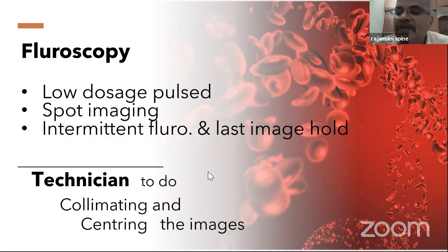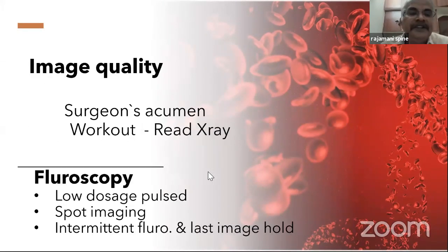But one major disadvantage of all these things is the poor quality of the images which you get. Probably you may get a poor interpretation. And then ask your technician to start early, let him collimate so that the radiation window is so narrow that you don't get exposure on the sides. So don't go wash up first. Once positioning the table and having the markers there, instead of asking the technician to start, ask the technician first to collimate and send the image, which will reduce the irradiation.